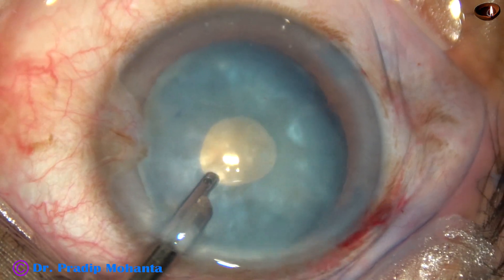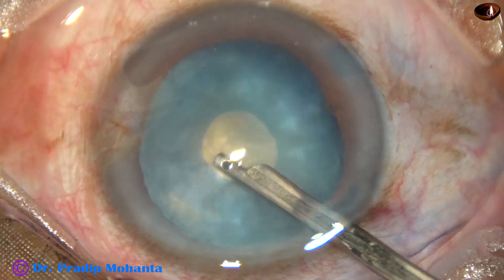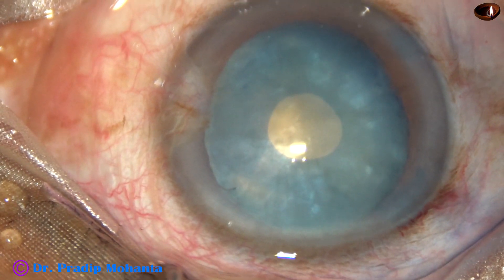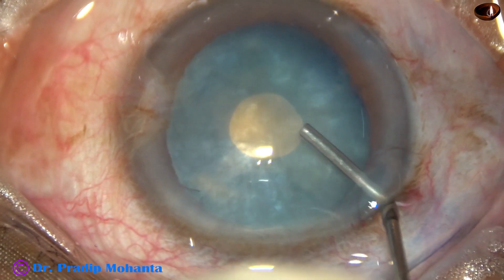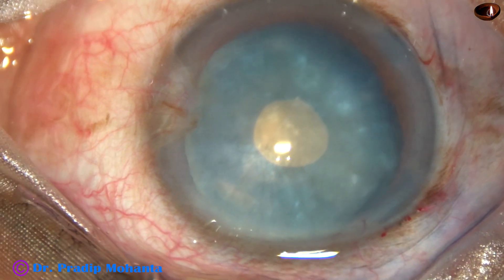Now, what has happened? The cataract is no longer an intumescent cataract — it is just like an ordinary cataract. Now I inject HPMC again. No sodium hyaluronate.